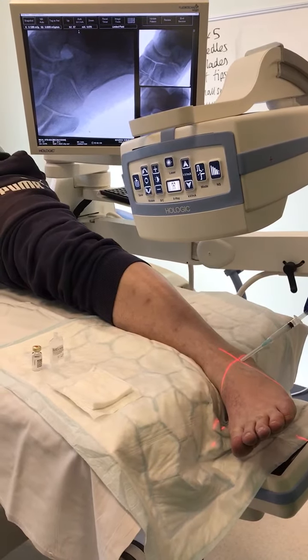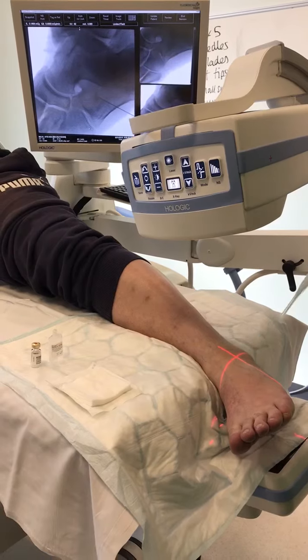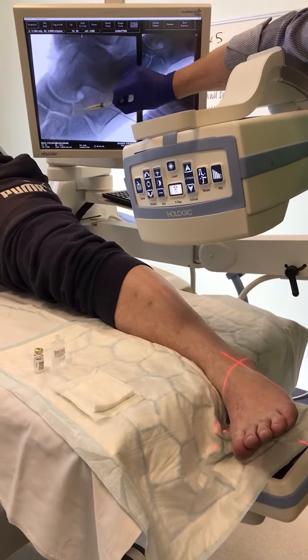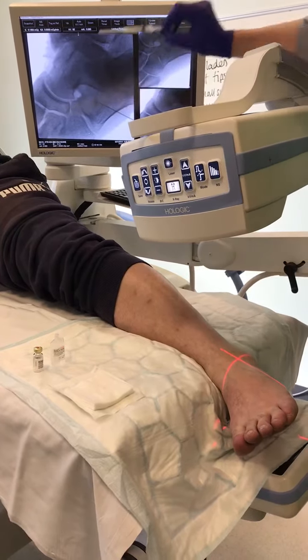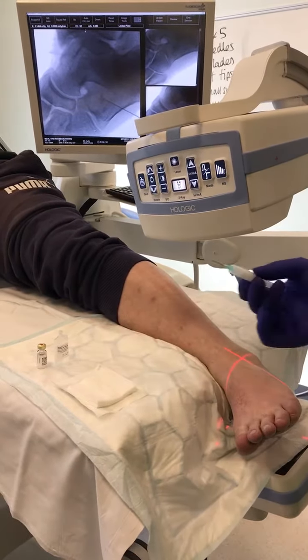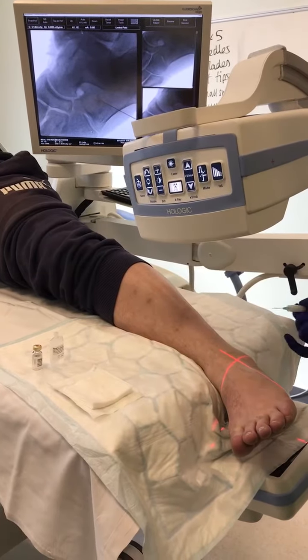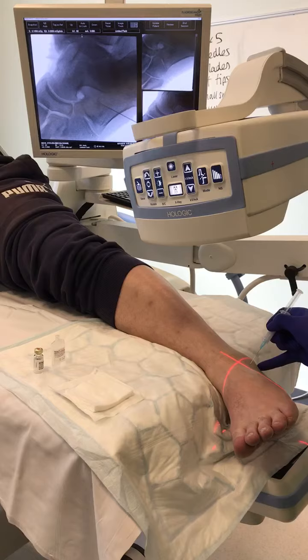So that's coming in around the calc. You can see there's a little bit of a cartilaginous synchondrosis there. We've already done the skin prep. We've got a mix of Kenalog and Naropin. Steve, little injection coming up.